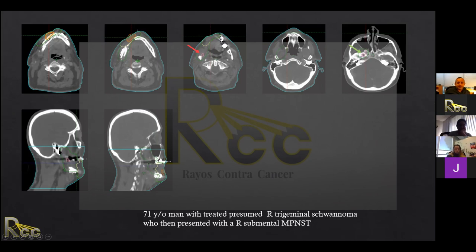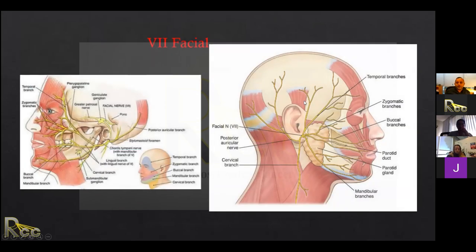And so basically, again, there's always dose painting going on here. So anything closer to the skin, away from the skull base, post-op doses, as I mentioned, 60 to 66 gray. So in this patient, the yellow here got 66 gray, so the immediate resection bed. The green got 60 gray. And then in this patient, since I was going only to foramen ovale, I actually took everything to 60 gray. But were I to chase intracranially, I would have created a third volume going to 54 gray.